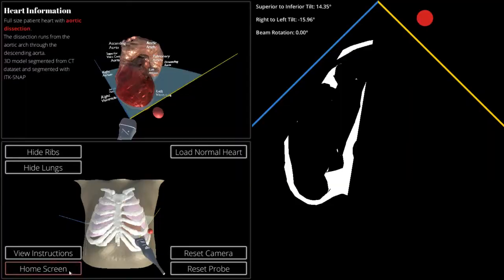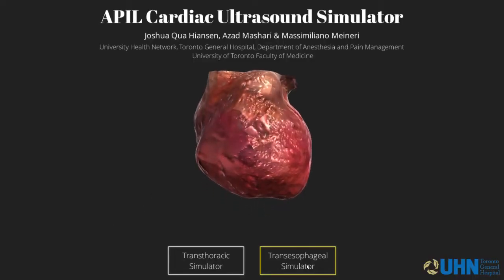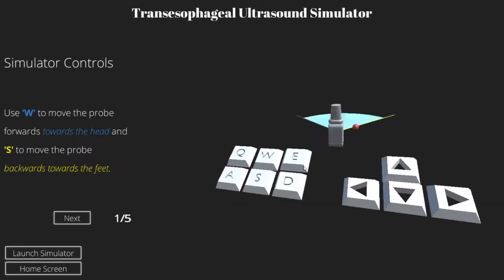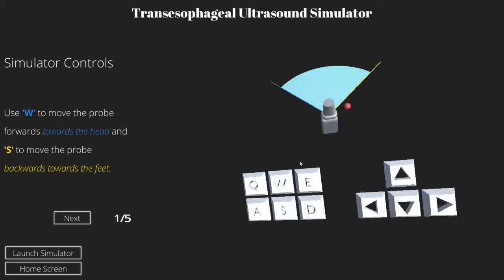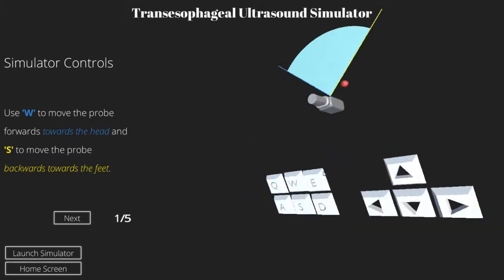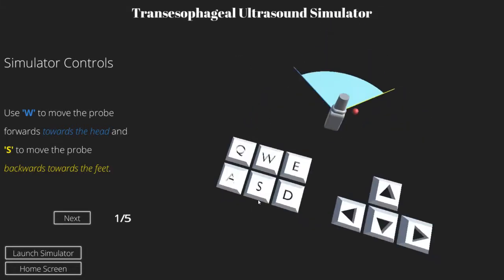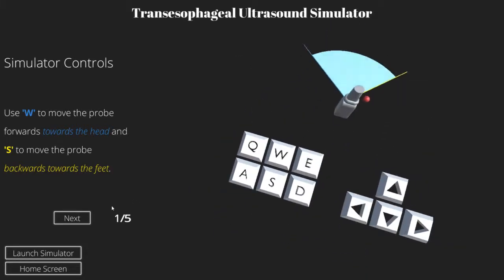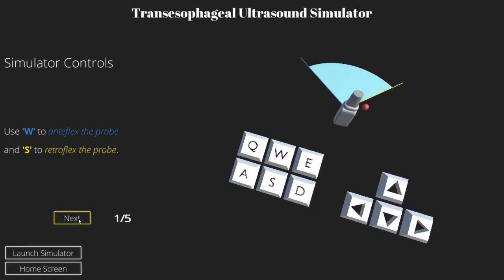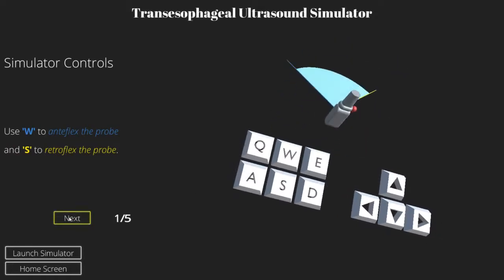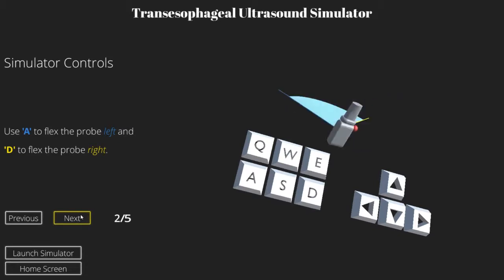Now if we go back to the home screen, we can switch to our transesophageal simulator. It's the same deal. Instead of a TTE probe, we get the head of a TEE probe. The instructions work the exact same way. W and S to anti-flex and retroflex the probe's head, respectively. A and D to flex the probe left and right, respectively.